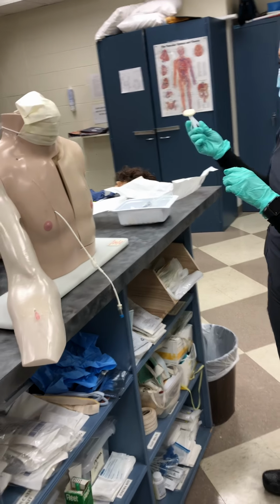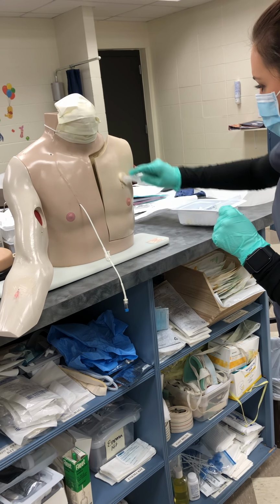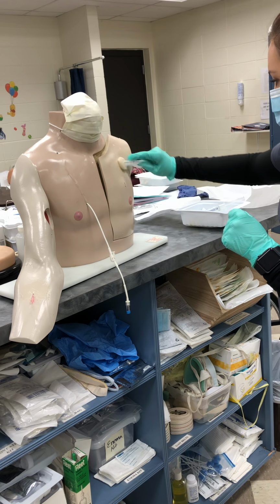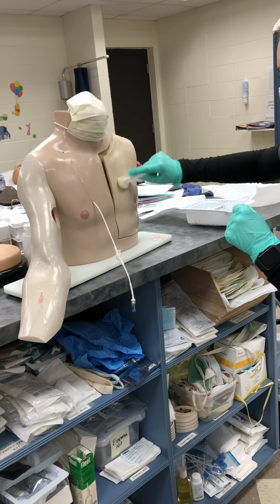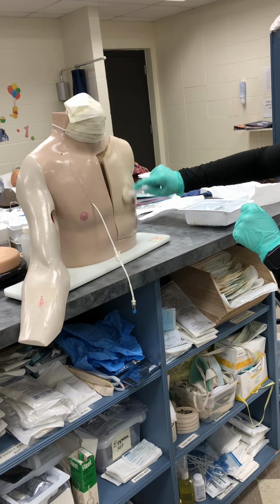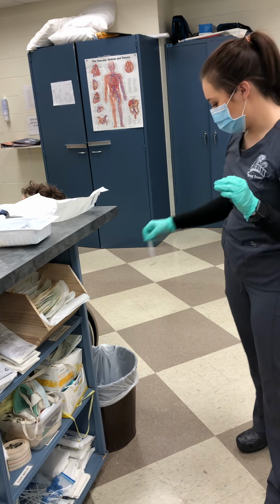I'm going to get my ChloraPrep and go ahead and clean. So we're going to clean vertically and horizontally about a 2 to 4 inch area around the port. So vigorous cleaning. This mannequin's kind of hard to clean just because of the plastic. Okay, so that's all clean. You're going to let that air dry, no fanning. Just let it air dry on its own and dispose of this.